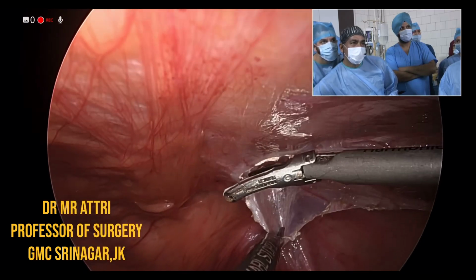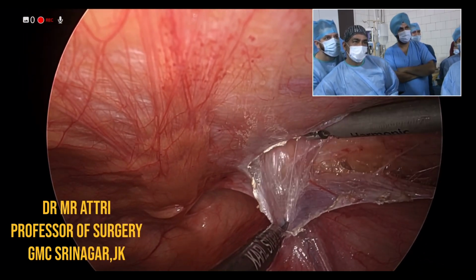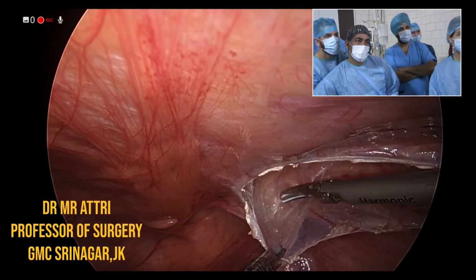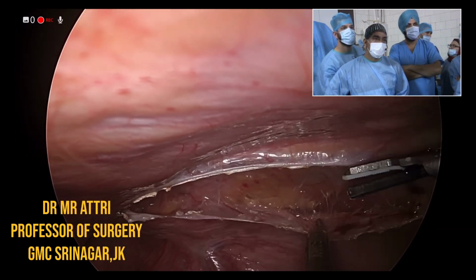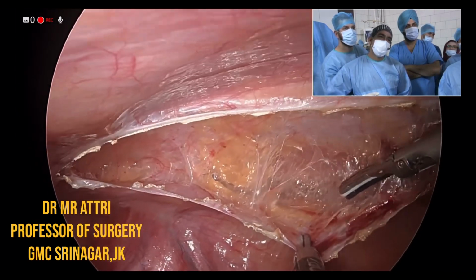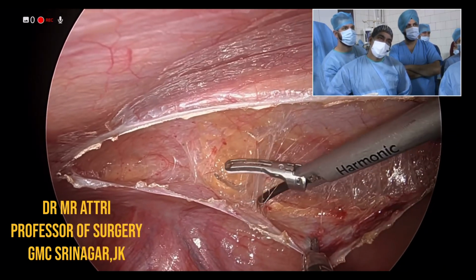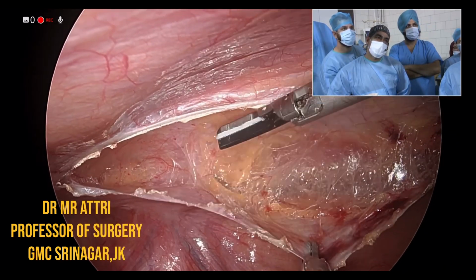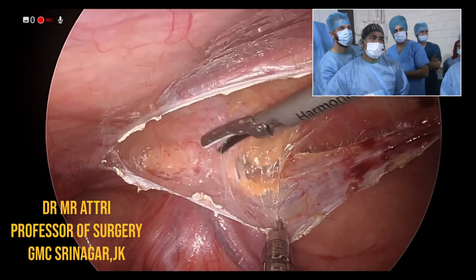And as we go medially, we have to take care of the inferior epigastric vessels, and we all know that the peritoneum is again a single cell layer, and the fat belongs to the anterior abdominal wall. We have to just, audiovisual team, can we have GOT1 on now?